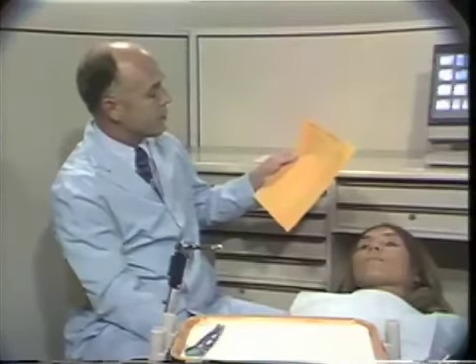And the following radiographic form, number 3D, is one we will use today, as well as the number 9B, A and B, the operative dentistry clinic worksheet and treatment plan.